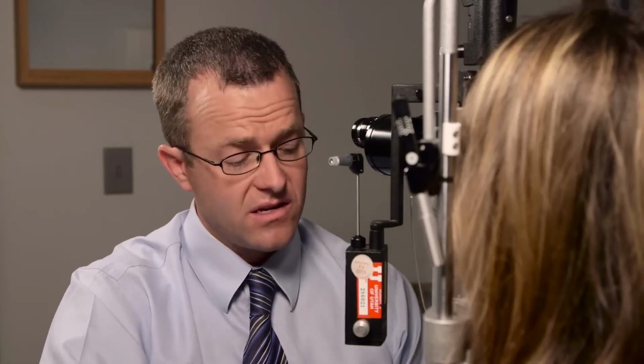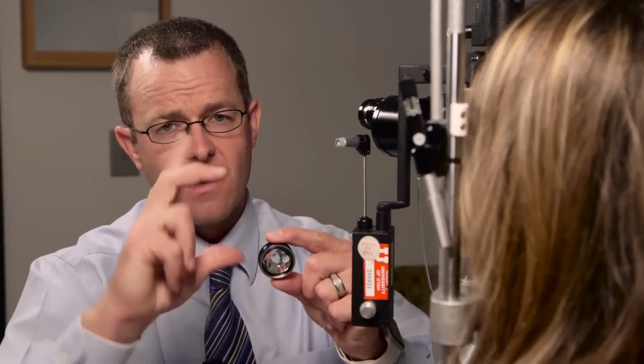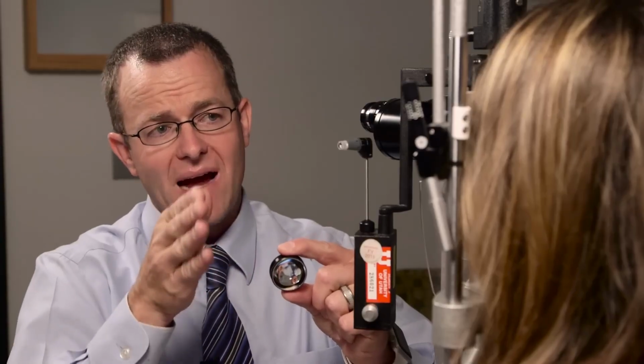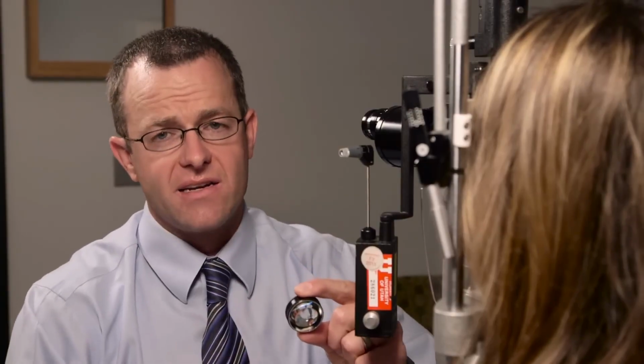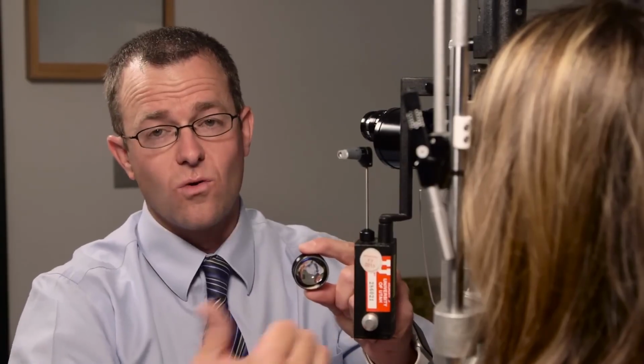And with macular degeneration, diabetes, and many other disorders, when there's swelling or bleeding in the macula, it will be the thing that affects their vision and why they came in to see you with vision complaints. And a good point to bring up with that is that these lenses reverse the images up and down and side to side. So the macula is always located temporal or lateral to the nerve of the eye anatomically. However, when you're doing your exam, to see it, you're going to pull nasal or towards the nose to be able to get those into view.